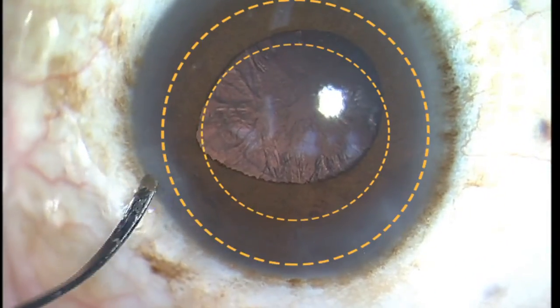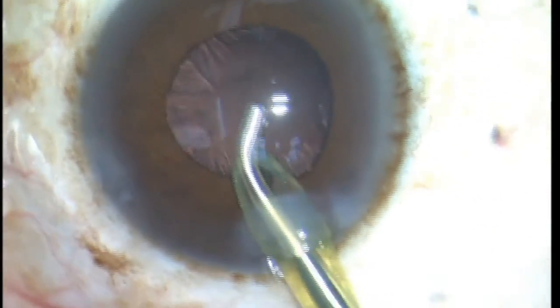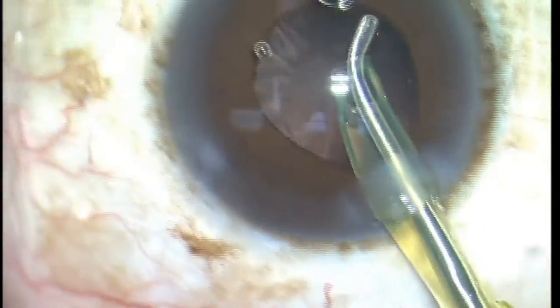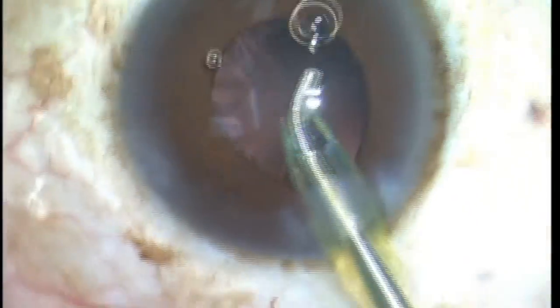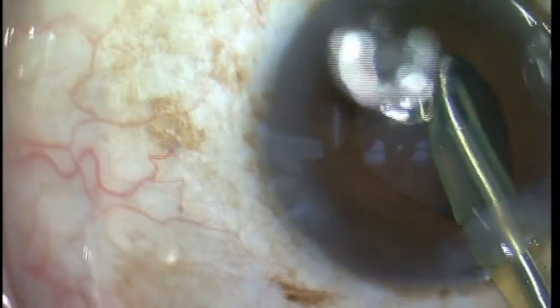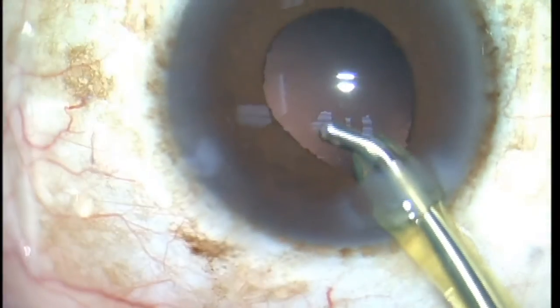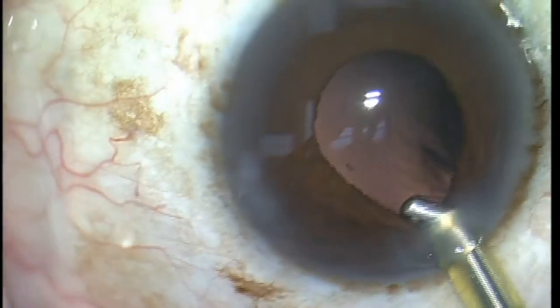Here I'm tucking the pupil back in, and you can see how much smaller the pupil has become. With about a 2.5 millimeter decrease in pupil size, you lose about 50 percent of your surgical view. The smaller the surgical view, the greater the risk of complications — things such as leaving a small piece of nuclear fragment in the eye, not being able to get all of the cortex out, not being able to see where to place the haptics of an implant, or not being able to visualize the dots on a toric implant.